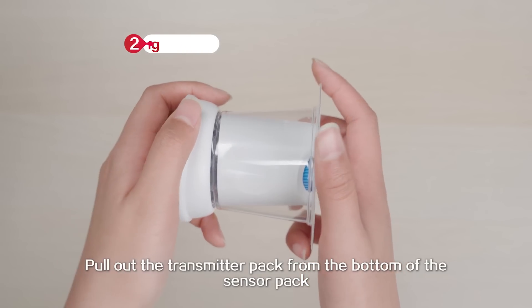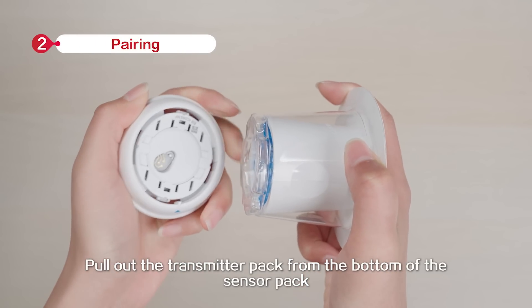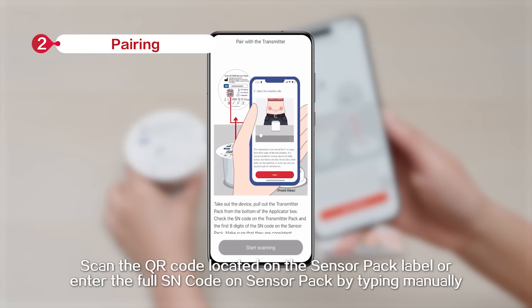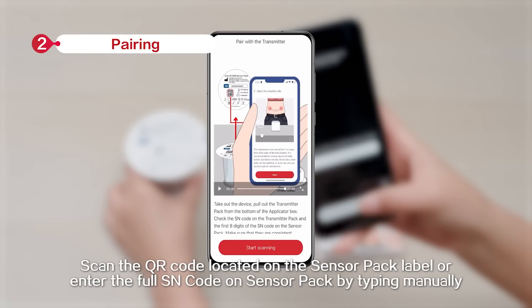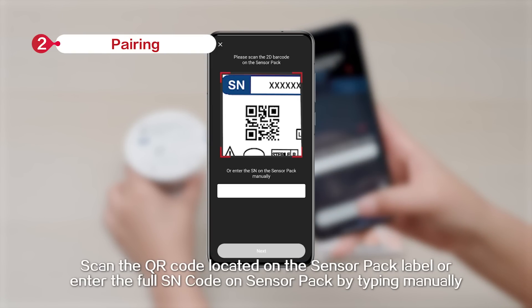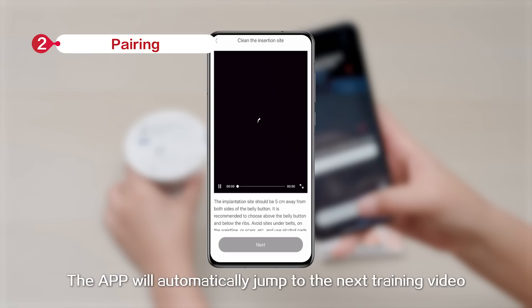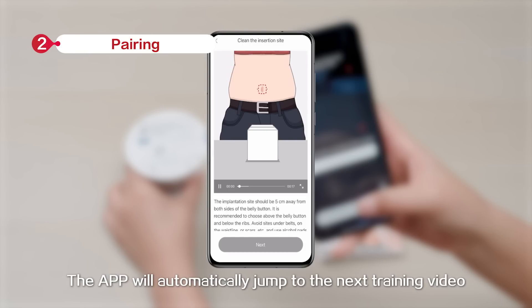Pull out the transmitter pack from the bottom of the sensor pack. Check that the first 8 digits of the SN codes on the sensor pack and the transmitter pack are the same. Scan the QR code located on the sensor pack label, or enter the full SN code on the sensor pack by typing manually. The app will automatically jump to the next training video.